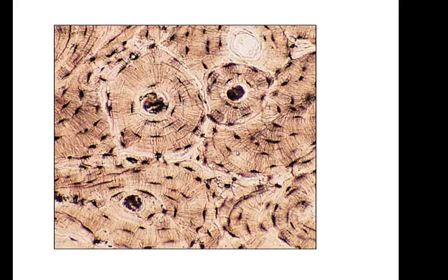And you could say its function is protection. You could say it's calcium storage. That's pretty much what you could say: protection and calcium storage. Support, all of those things. Here's another view of bone. It has a very characteristic look. Hope you don't miss this one. It has a solid matrix, solid collagen matrix. Here's another picture of bone. Hard to miss bone. Bone looks like this. Never any color to it. You don't have to stain bone.